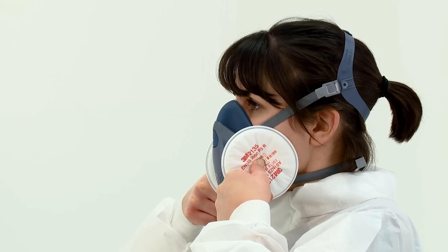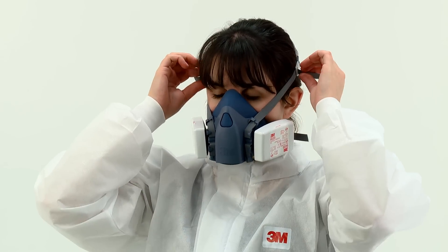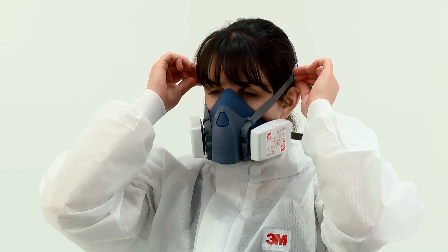If it does not and you detect air leaks at the seal, adjust the fit, taking extra care with the tension adjustment of the straps. Then repeat the fit check.